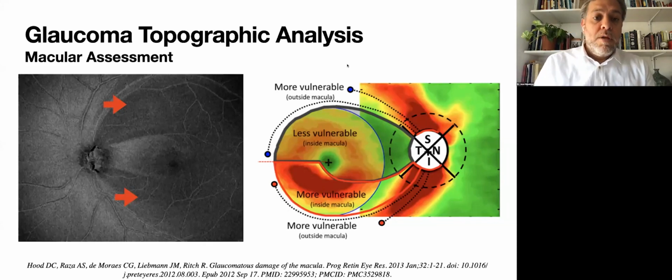I recommend using the same doctor who performs the tomographies, considering the artifacts. Well, yes, the same doctor, the same technician. If that's not possible, be sure to train them as best as possible and make sure they are aware of this type of defect.